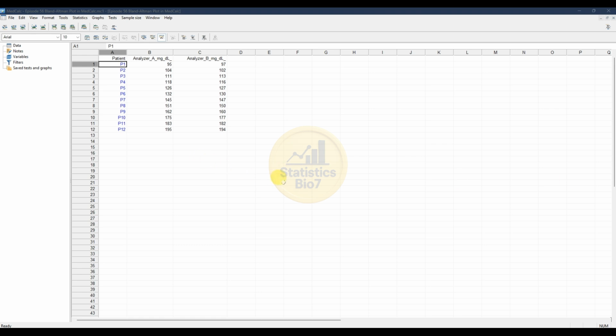In today's video, we will discuss an example biomedical dataset comparing blood glucose levels measured by two laboratory analyzers, for patients P1 to P12, with analyzer A as one instrument and analyzer B as the other instrument.